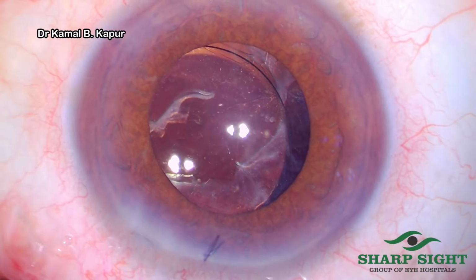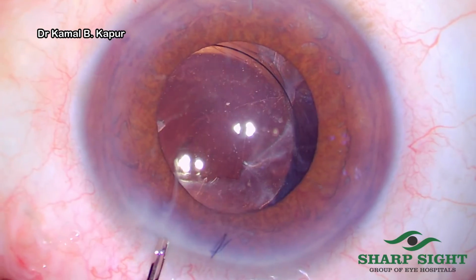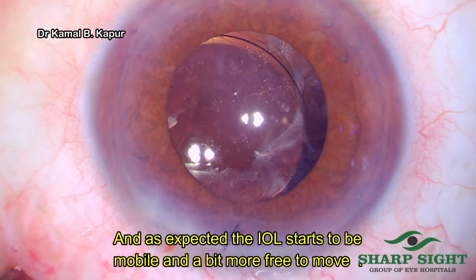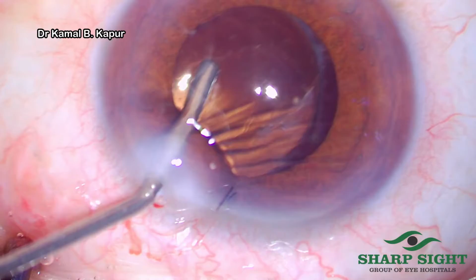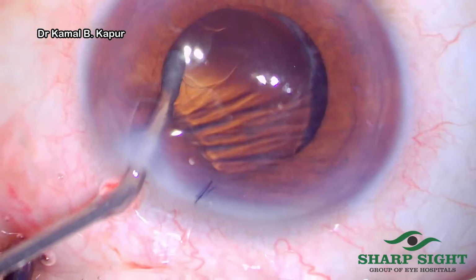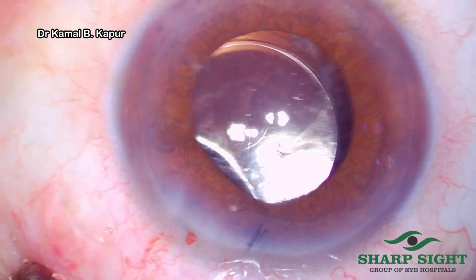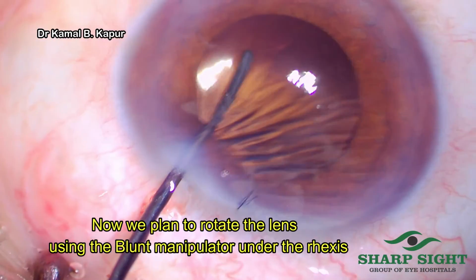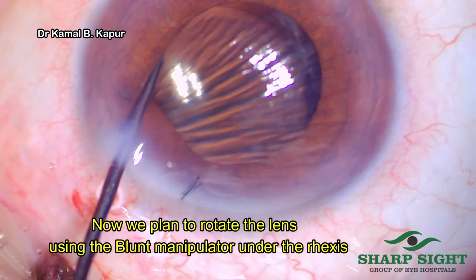This has created some space for us within the capsular bag and the constrictive forces of the capsular fibrotic tag are reduced. Now we will all notice that the IOL is more mobile than earlier and the constricting pushing forces are reduced, but still it has not achieved what we wanted. We try dialing the lens again and see whether we can now dial the lens in its position.